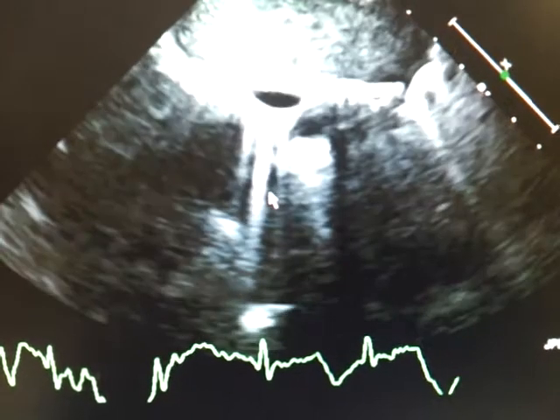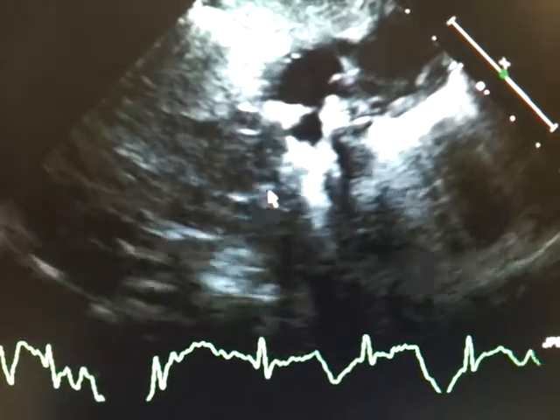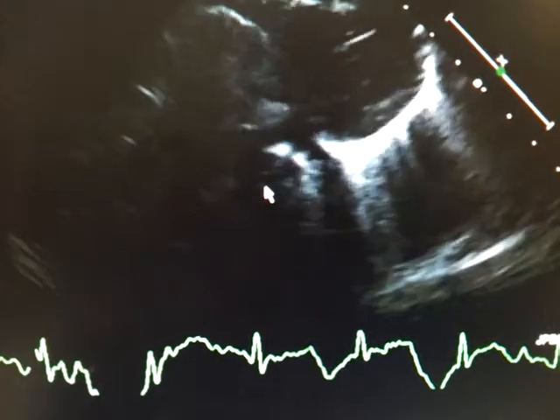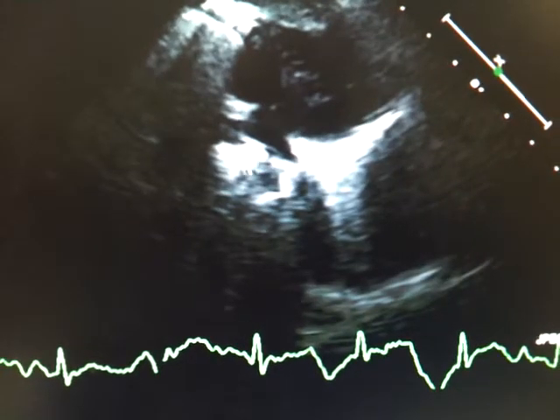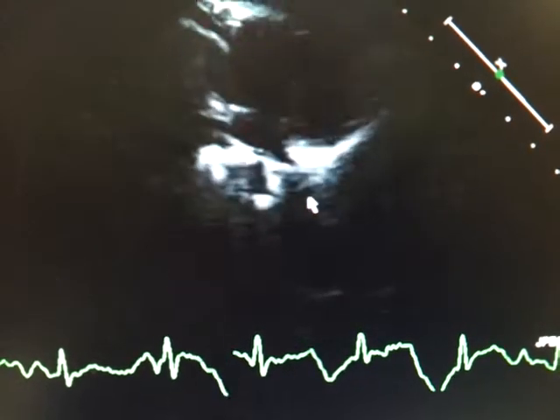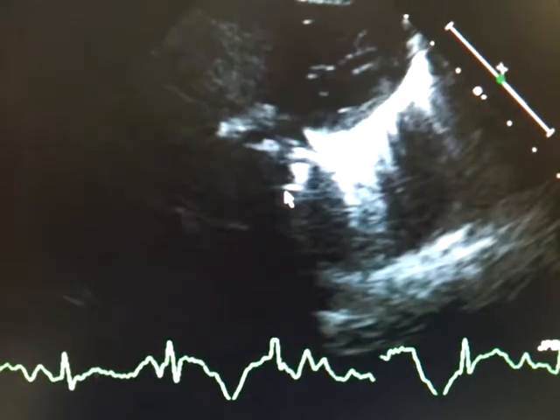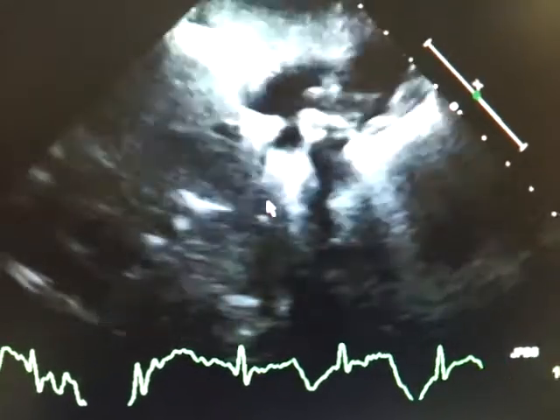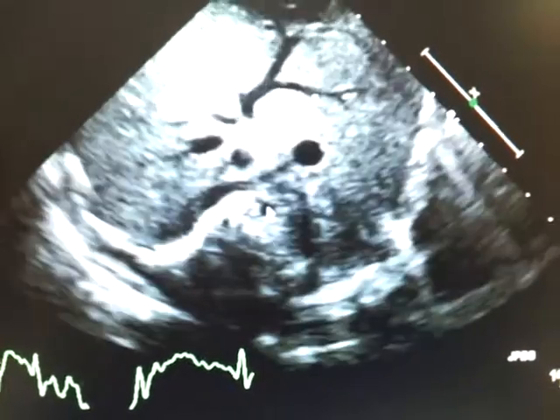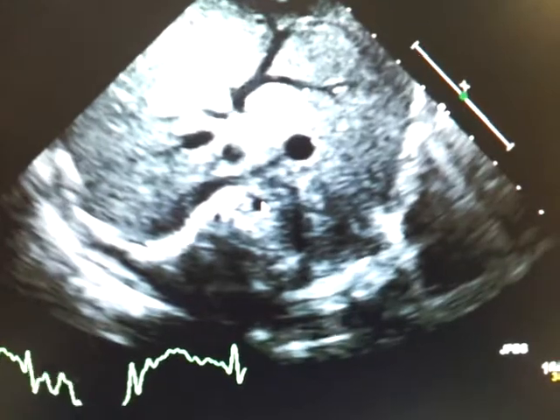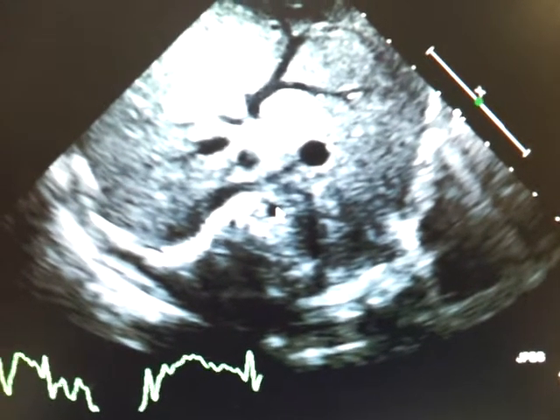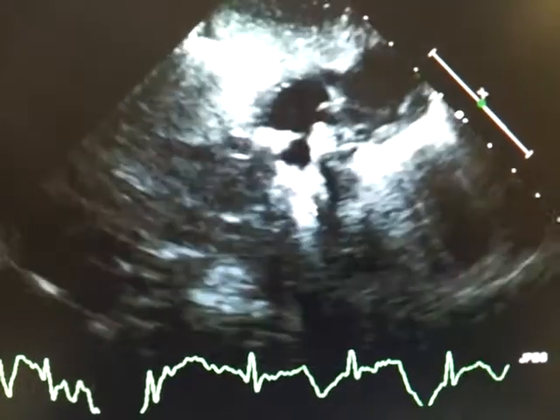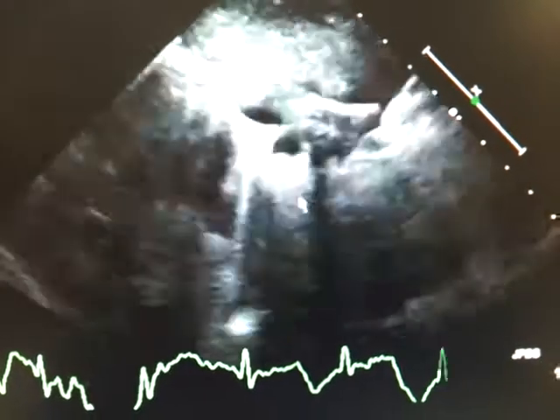Follow this descending aorta, which is more posterior, right there, to the heart. Definitely an interesting case. For cardiac, a total anomalous pulmonary venous return to the liver. We'll turn it over. Thank you.